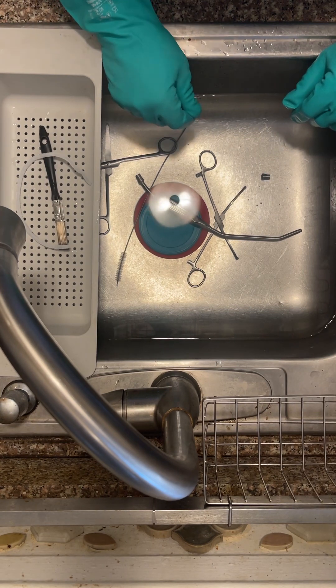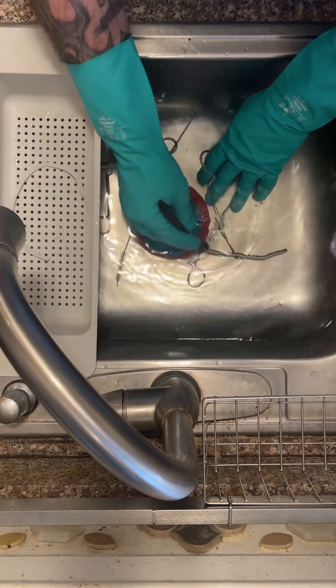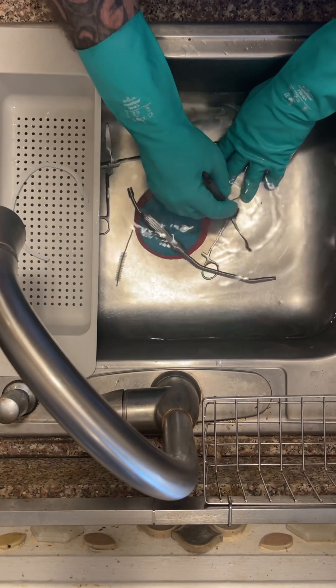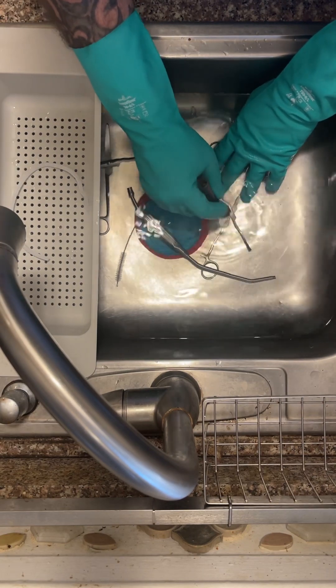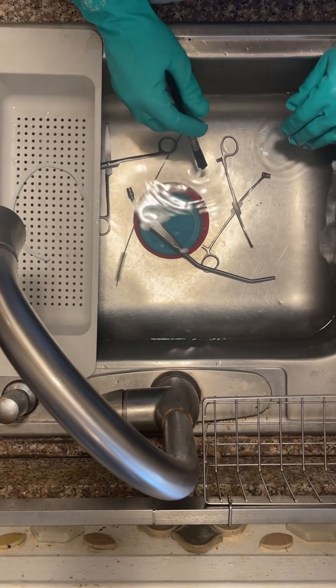Whenever you're doing your cleaning, make sure to get all of the box locks and wherever there is any place for biofilm to hide. Always scrub under water.